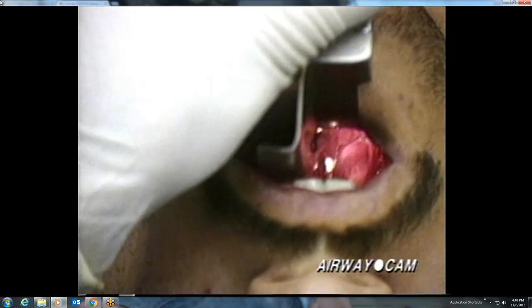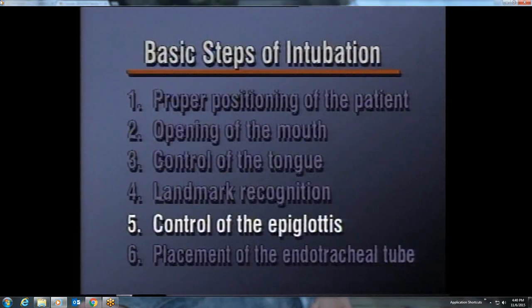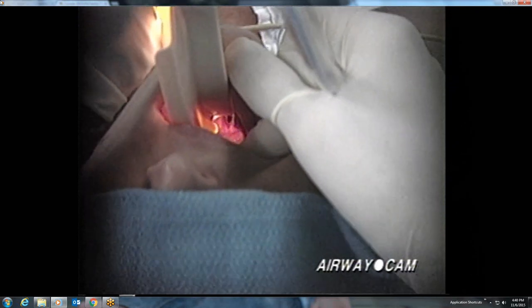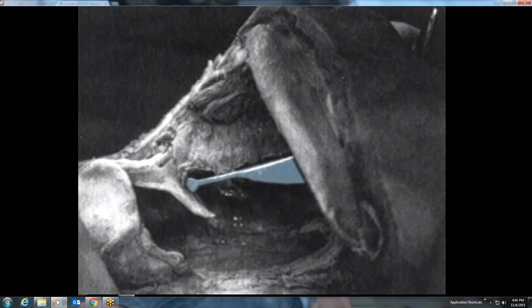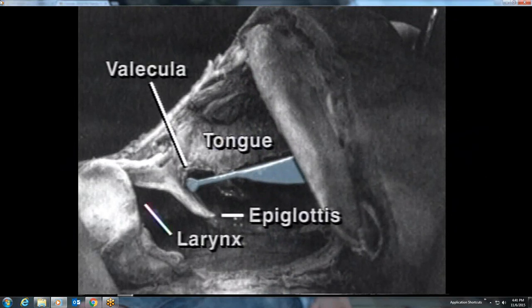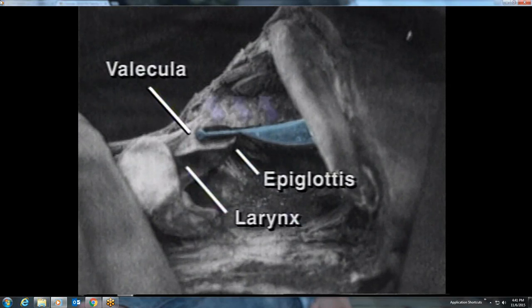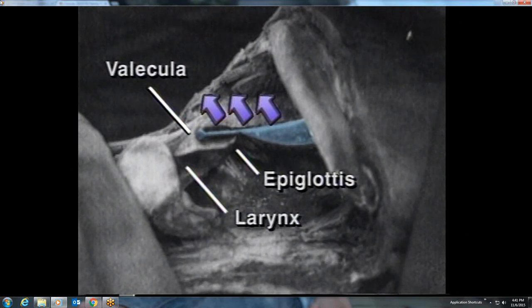The fifth step involves control of the epiglottis and exposure of the larynx. With the curved blade, the epiglottis is lifted indirectly by pressure on the vallecula and the underlying hyoepiglottic ligament. On this cadaver cross-section, note the differences in the epiglottis when the tip of the blade is loosely applied to the vallecula, and when it is firmly pressed, causing the epiglottis to be lifted upwards. Traction on the laryngoscope in the direction of the handle causes elevation of the epiglottis when the tip is correctly placed.